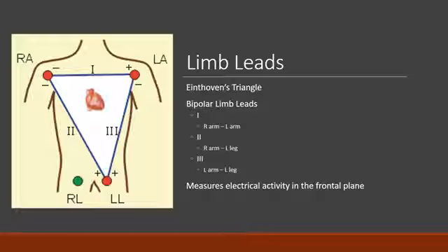Now, the other thing that this does is, if you imagine a person standing up and placing these EKG leads on, that gives us information in the frontal plane, kind of the vertical part. So that's one half. We need to know in kind of 3 dimensions. So we've got one plane here.